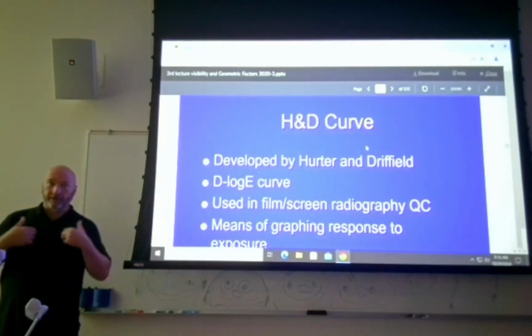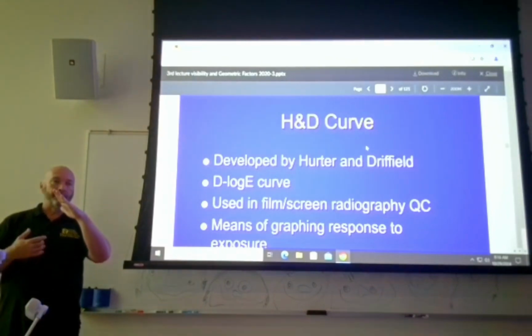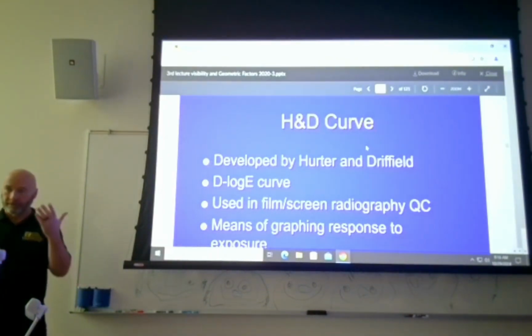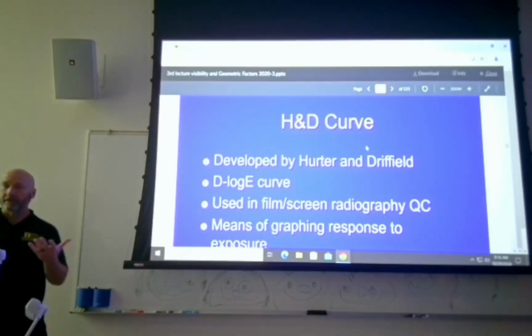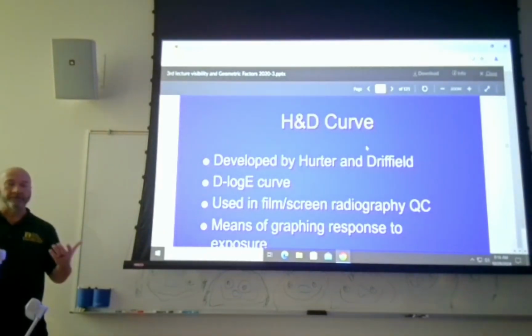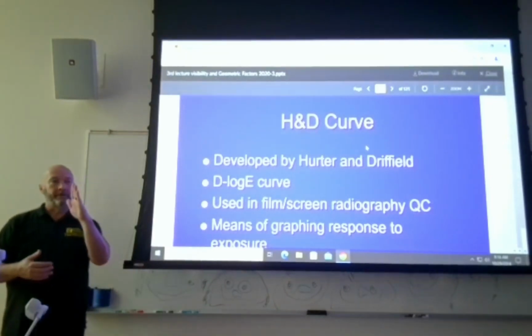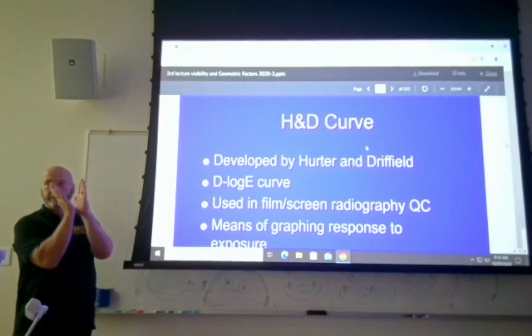The chest computer algorithm for the thoracic viscera, though, is not going to be very vertical. It's going to be more horizontal because what are we looking for? Are we looking for the bones where we want the bones to stand out? Answer is no. We don't. We want the bones to kind of dissolve a little bit so that we can see that soft tissue, right? So where your computer algorithm for the rib needs to be high contrast, the one for your chest x-ray needs to be lower contrast.